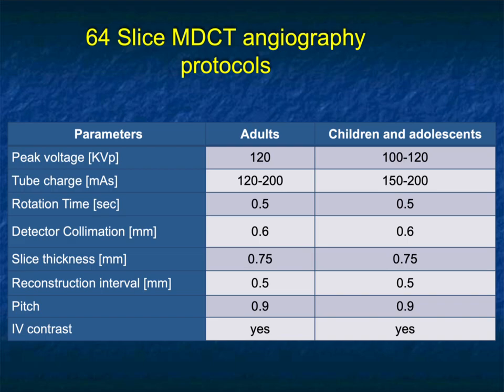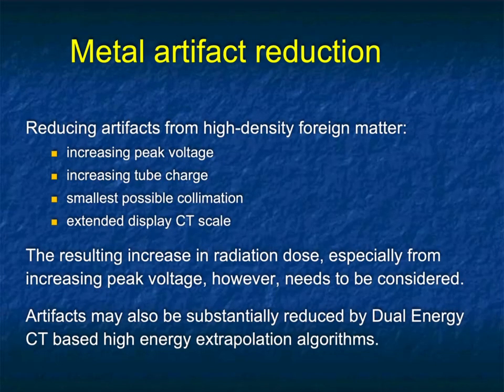Again, in the ER setting, we always recommend people get really good scanners. Remember, the ER is 24/7. In your hospital, the ER is probably going to be the scanner that's used the most because in the middle of the night, in the middle of the day, the ER scanner is always there, and it becomes a very critical resource.